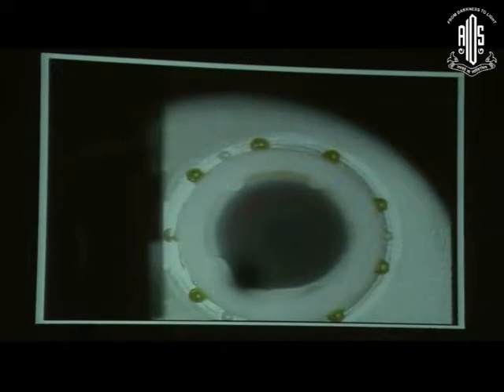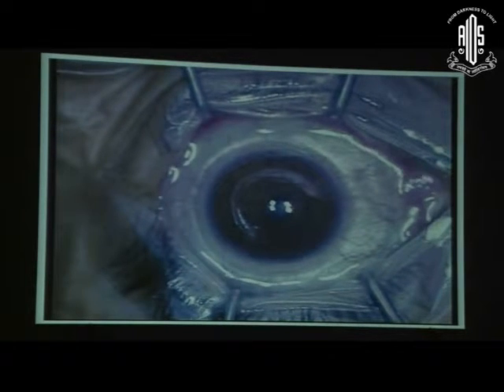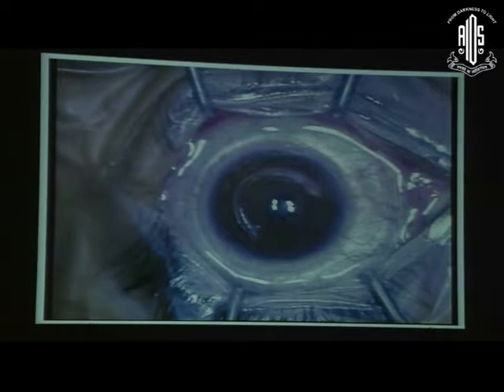So here you mark the geometric center of the cornea, apply your femtosecond laser, and create the channel. The advantage is that you can create individual channels for the inferior and the superior segment, and you can match the width of the channel according to the size of the ring that you are implanting. So you can choose, say, a 450 inferiorly and a 210 superiorly. So the width of the channel will be according to the size of the Intacs. So it will not be the same size as what you do when you create it manually.